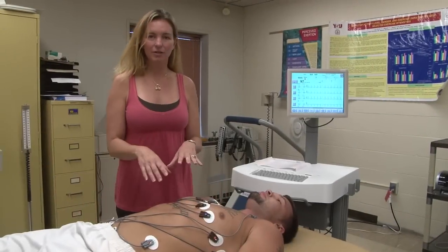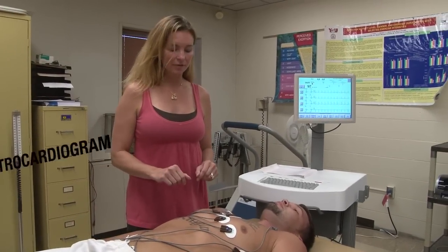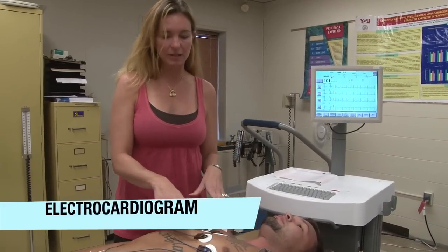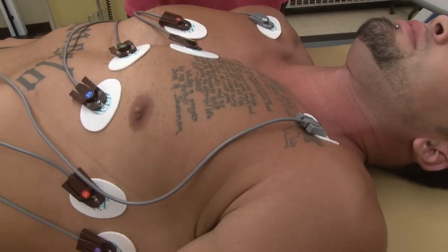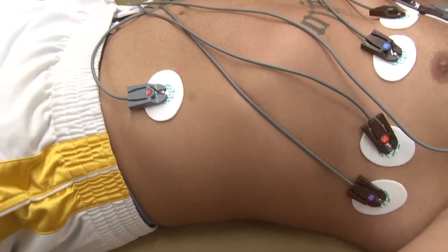Okay, we have our client hooked up today on a 12 lead, and if you're looking at his placement of his electrodes, you'll notice there's only 10 leads, or 10 electrodes. But 10 electrodes transfers into 12 leads, and I'll show you how.